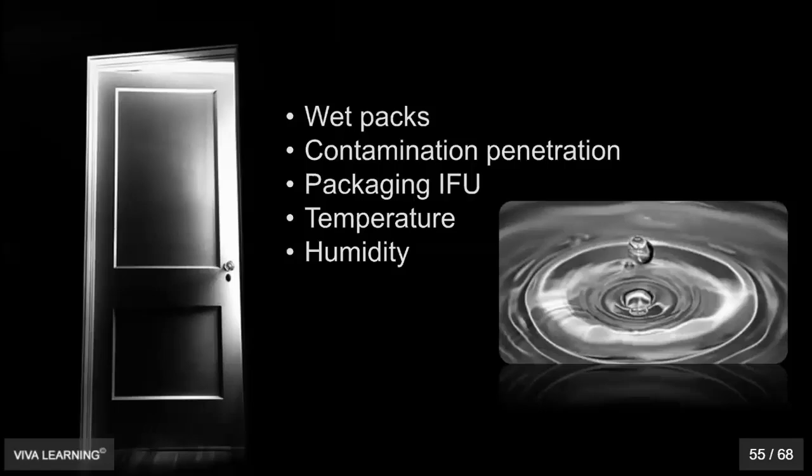If you do have wet packs, you need to find out if it's an incidental occurrence. It's not common. If it's become common, you need to look into and figure out what's causing this. And wet instrument packs cannot be released. If it's always in one particular area of the sterilizer, it could actually be that something is wrong with the sterilizer itself. So you have to do a little bit of work when you are dealing with wet packs.